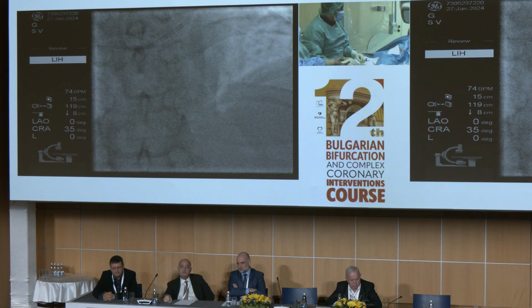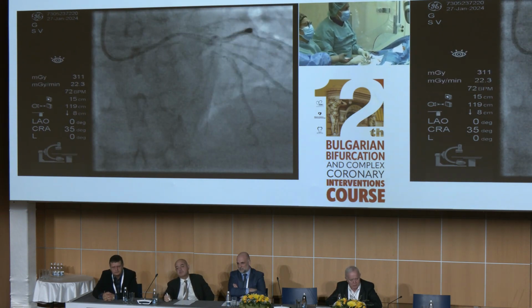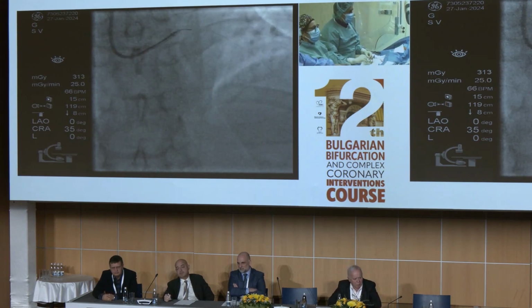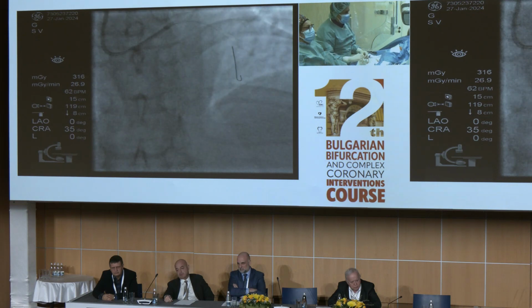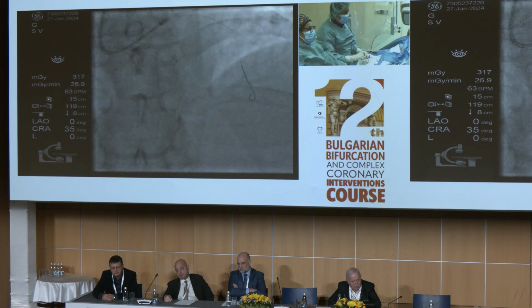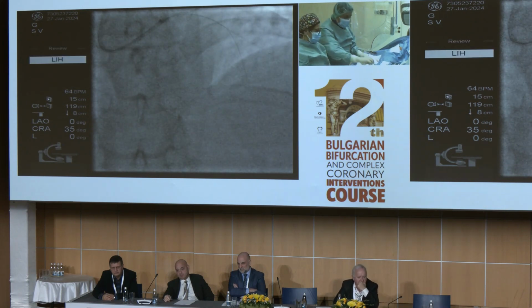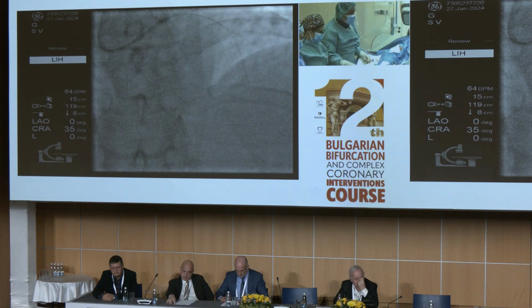But yesterday, all the discussants felt confident about the high likelihood that the lesion would be relevant, so we thought it would be more educational to show with IVUS how we select the sizing of the stents, how we select the balloon for POT, and how we check the final result, because we intend to use a kind of novel technique invented by Bulgarian interventional cardiologists.